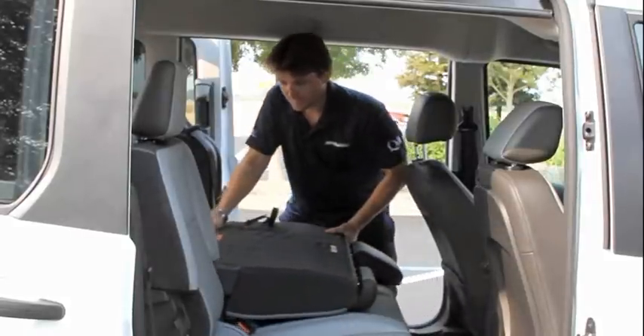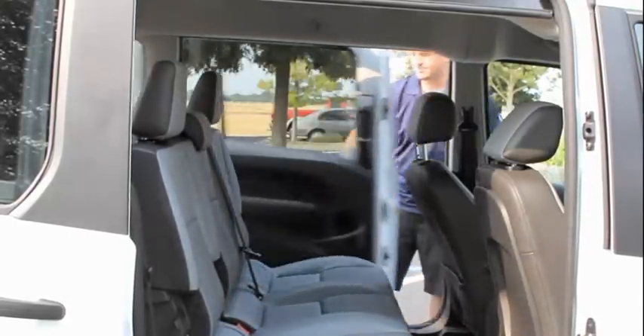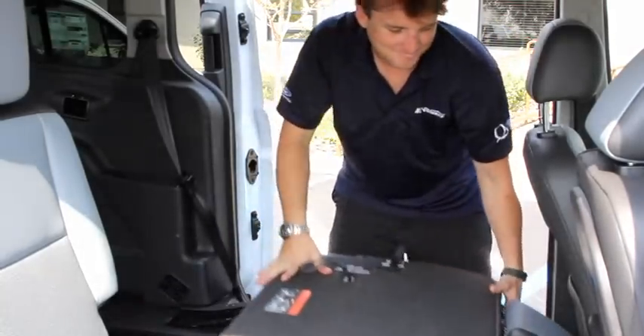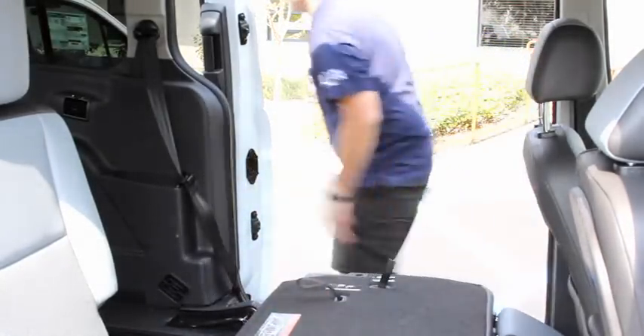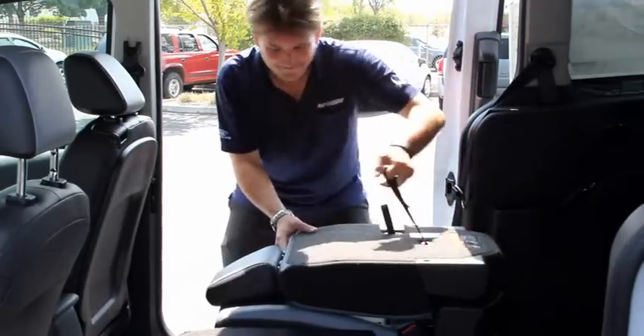Now adjust the belts to fit the occupant. After your wheelchair occupant is secure, you can return the seats to the upright position. From the stowed position, fold the driver's side second row seats forward, and then fold the passenger side second row seat forward.